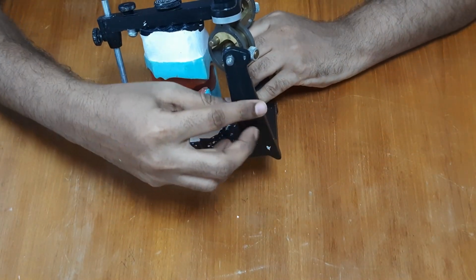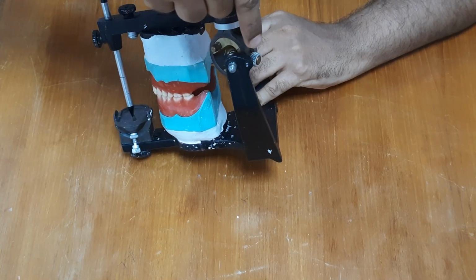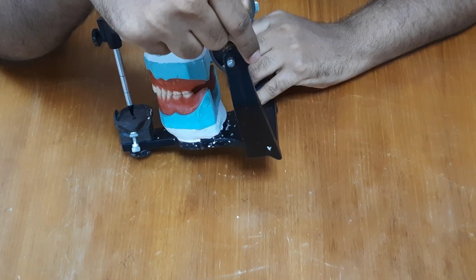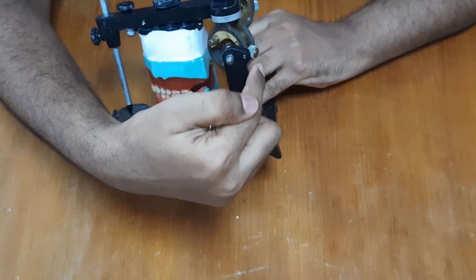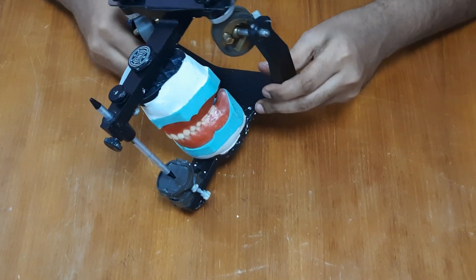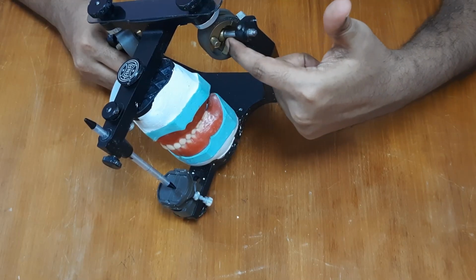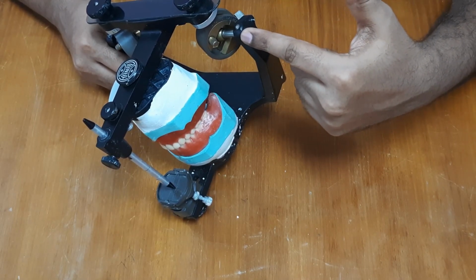At the top of this vertical arm is a roll pin or auditory pin. It is just a small metal pin projecting outwards, and the earpiece of the face bow will fit into this roll pin. Anterior to the roll pin is the condylar shaft. It is attached 12 to 13 millimeters anterior to the roll pin.